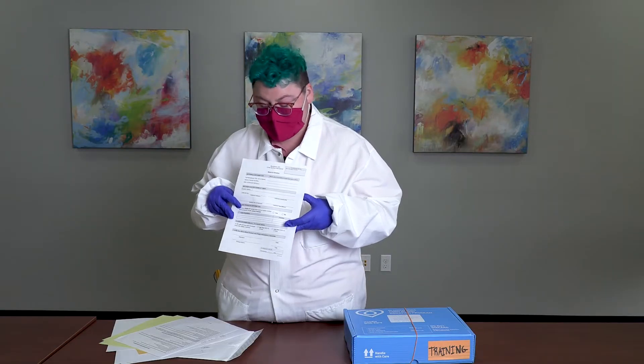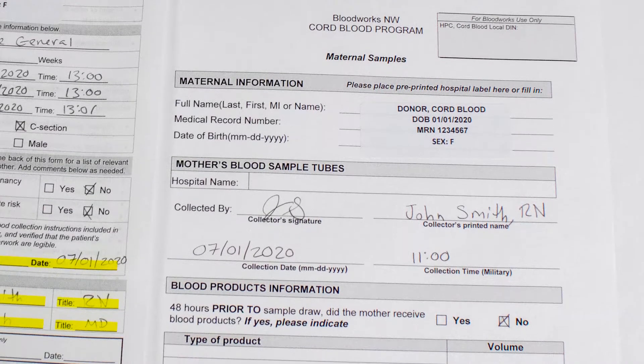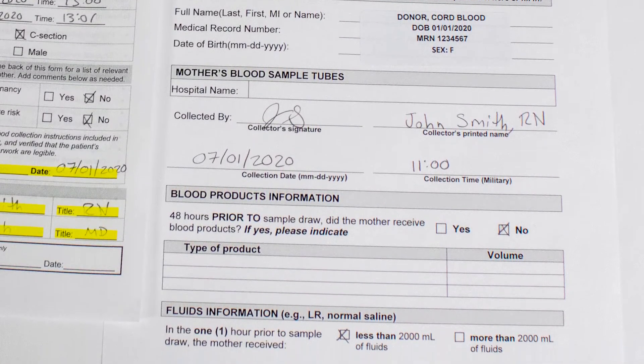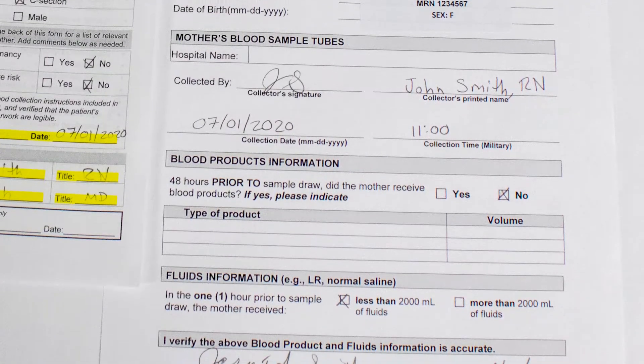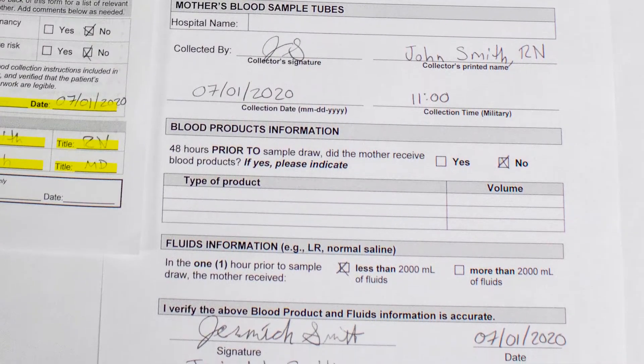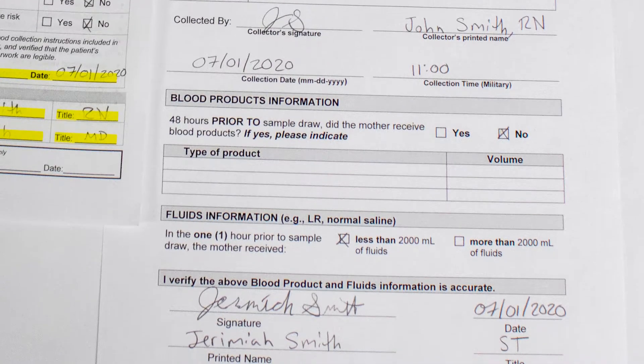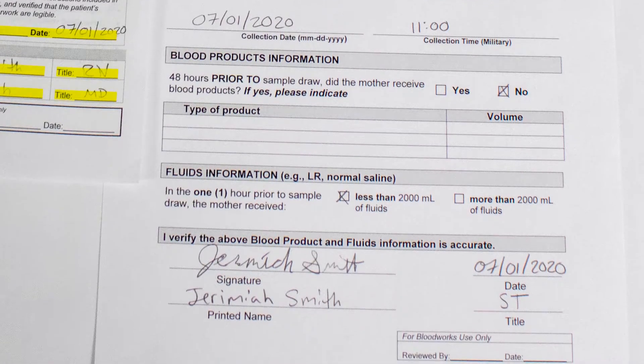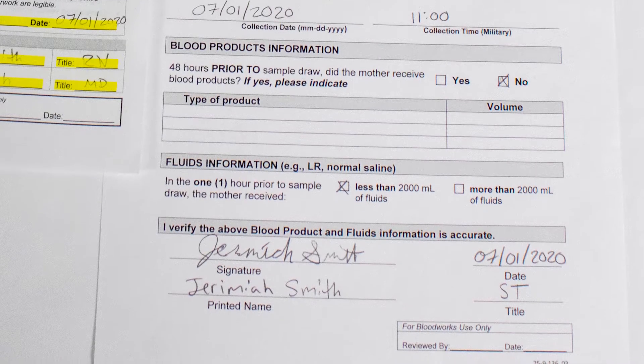The next form for hospital staff is the maternal sample form. Maternal samples can be collected prior to delivery or after the Cord Blood Collection. This can be completed by the person who collects the maternal samples — a nurse, phlebotomist, or lab tech. The bottom of the form verifies that the information listed above is correct.